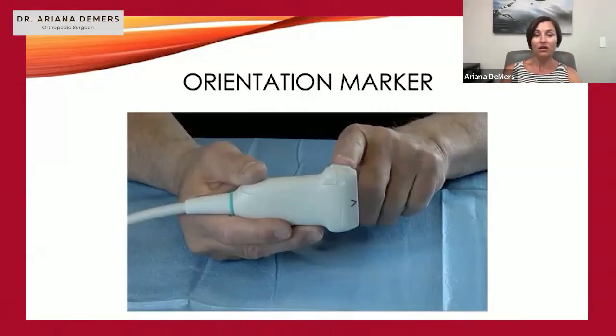Now, ultrasonographers are pretty particular about these orientation markers on the screen, and they have some recommendations to always keep it one way or the other. Some injection-based physicians are variable and place the anatomic structure oriented as the patient is when they're looking at them to help with needle guidance and needle craft. So that is going to be up to you depending on what you do for ultrasound use.